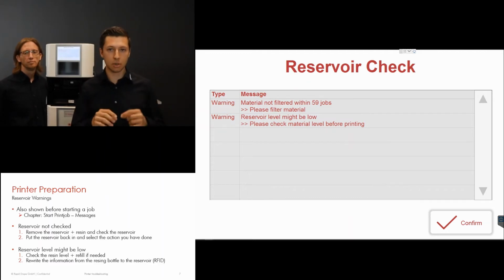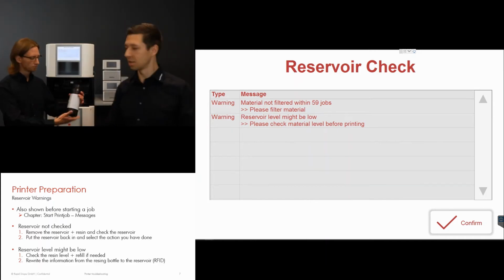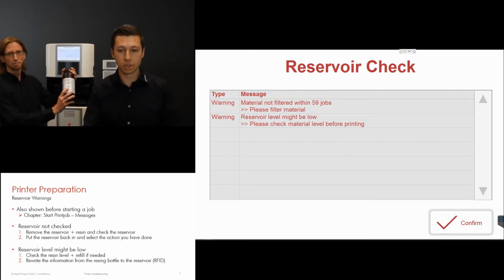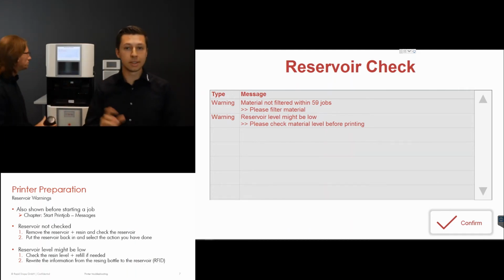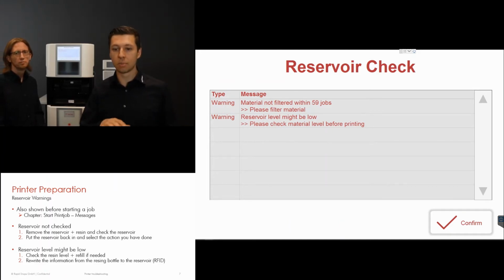The machine is just calculating once you put in the RFID, so the information from the bottle. If you hold the RFID to the machine and write it on the machine, then the machine knows the reservoir is now refilled up to its maximum level, and then it will calculate from job to job with each volume when the material level might be low.